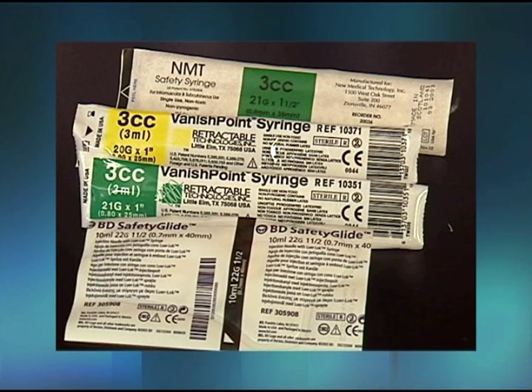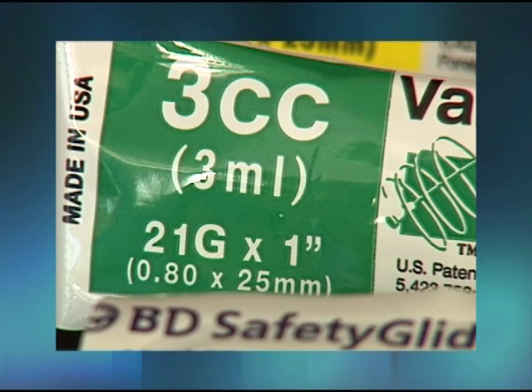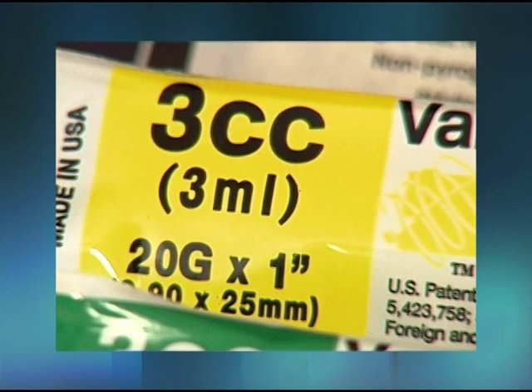The length of the needle for an IM injection varies from 1 to 3 inches depending on the size of the patient. A 1 inch to 1 1/2 inch needle is typically used for an average-sized adult. The gauge of the needle ranges from 18 to 23 and depends on the thickness of the medication being administered. Thick and oily medications require a needle with a bigger lumen.